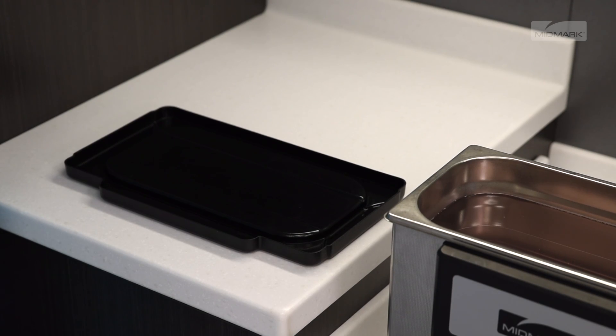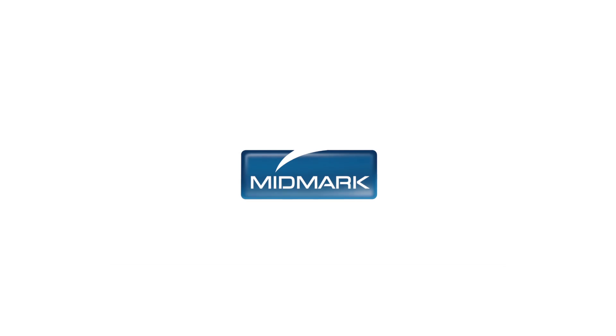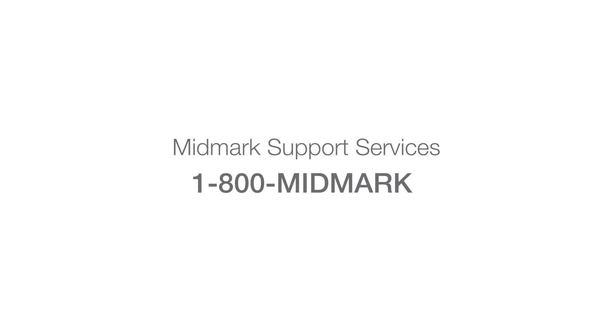One last note: your Quick Clean lid can be inverted and your basket placed on top to catch any excess liquid. For more detailed information about how to operate your ultrasonic, please refer to the Quick Clean user guide. For further support, contact Midmark Support Services at 1-800-MIDMARK.